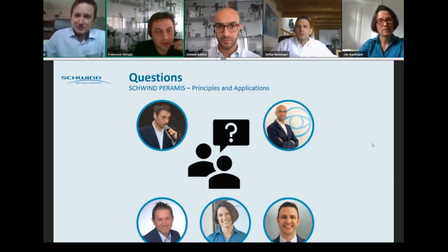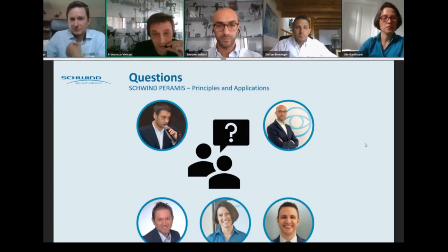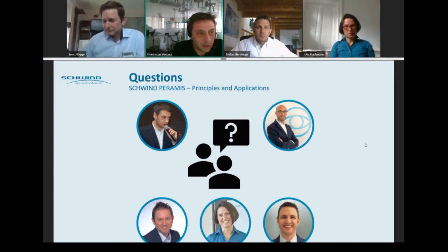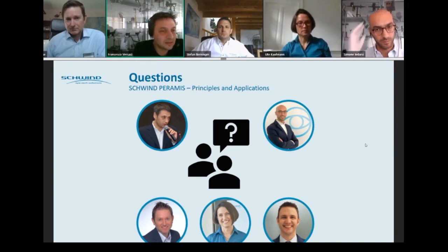What you can do actually is to select single aberrations and see the impact on PSF and MTF. So if you want to have an idea of how each single aberration is impacting vision, you could select, like in the slide that I just showed to you, the one from Jorge Alio and the one from Theo Seiler. You can select the single Zernike components and check the changes in the PSF in order to evaluate if it's something that is mandatory to be corrected or can be left untreated.